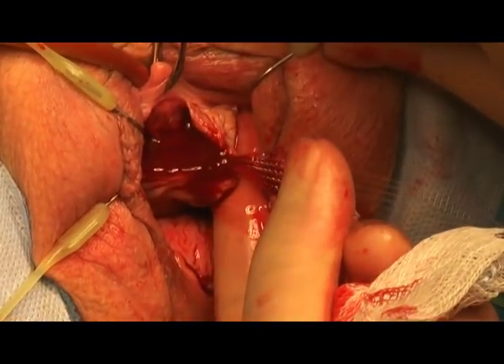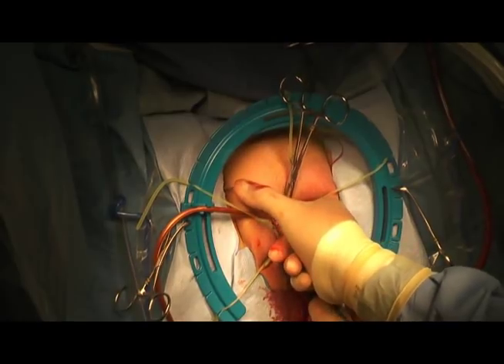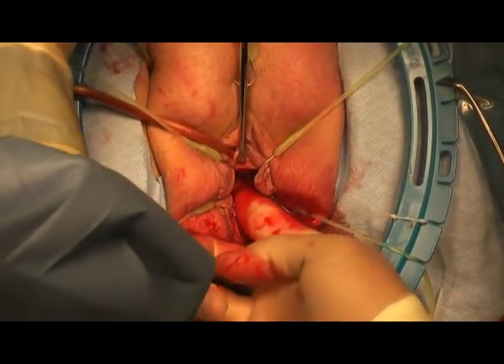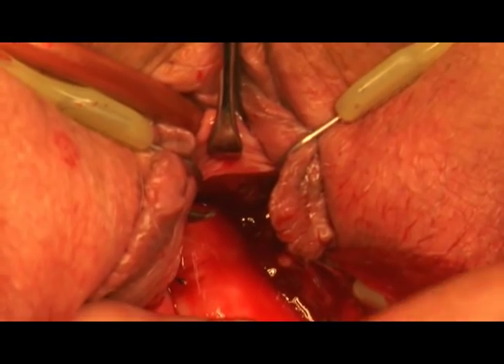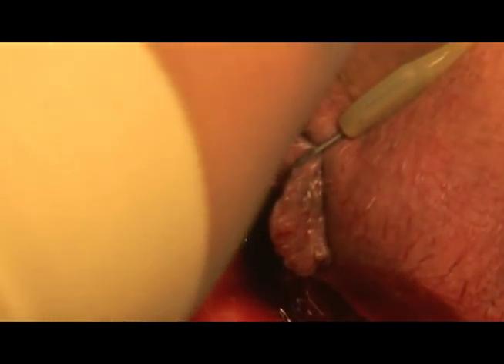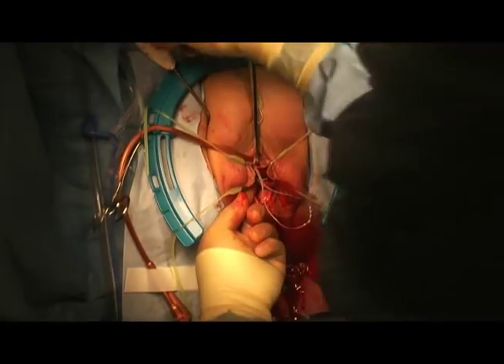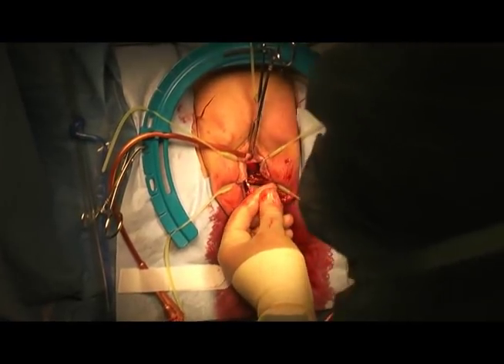Next, check the sulcus and make sure you have no button-holing. Now we're working on the patient's right side. My right index finger is in the tunnel, my left hand holds the needle, and my right thumb has just pushed the needle through the obturator space while my right index finger looks for the needle tip. Here's the needle coming out through the vaginal incision — again, I'm not torquing the needle through with the handle. I'll place the end of the omnisure sling through the eye of the needle and grasp it once it's through. You want about five centimeters or slightly more pulled through before you reverse-turn the handle of the obturator needle. Stabilize the middle of the mesh so it doesn't get wet as you reverse-turn the introducer needle.